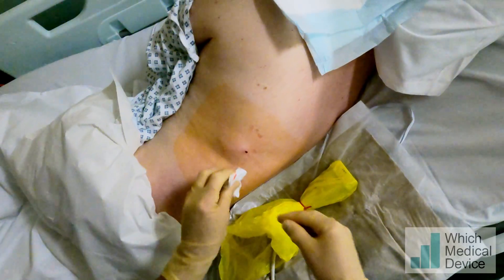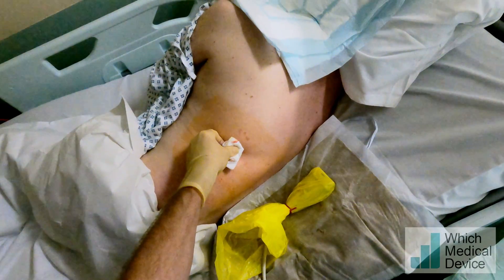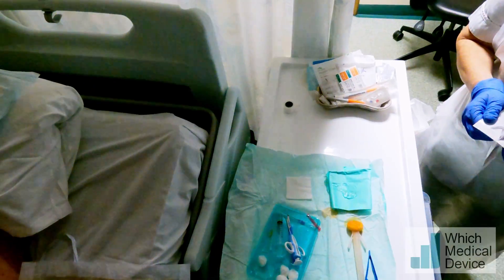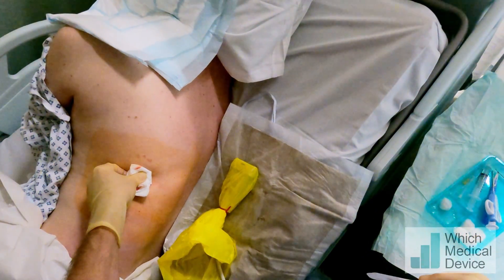I'm just going to press on that just for a moment or two — just a little bit of oozing from the skin. We'll put a little dressing on. Did you feel any of that? Yeah, the initial needle about four minutes ago, a bit of pushing. But nothing particularly sore. Excellent, that's what we aim for. Was that better than you thought? A lot better. Good.